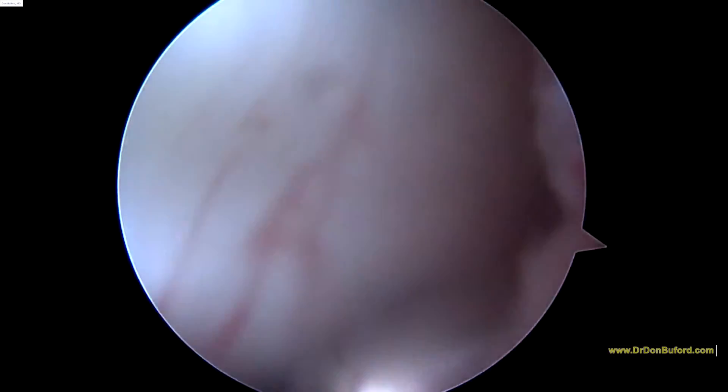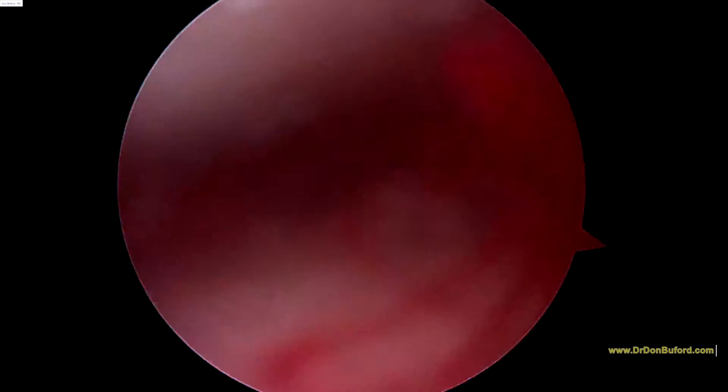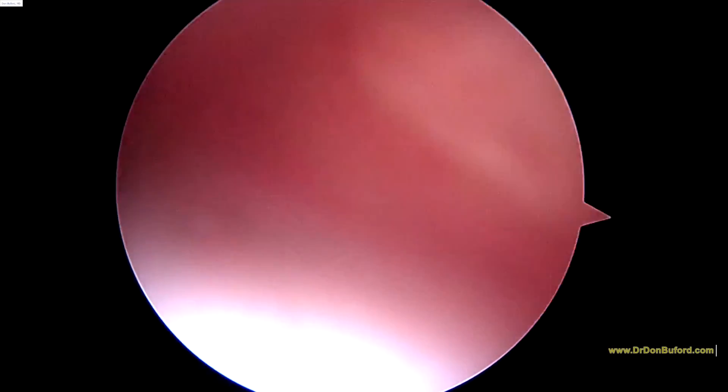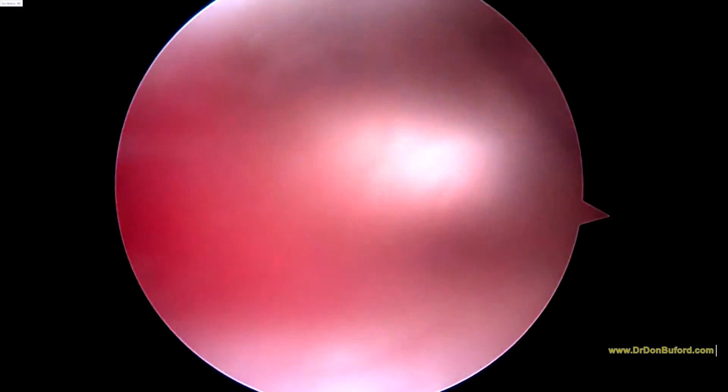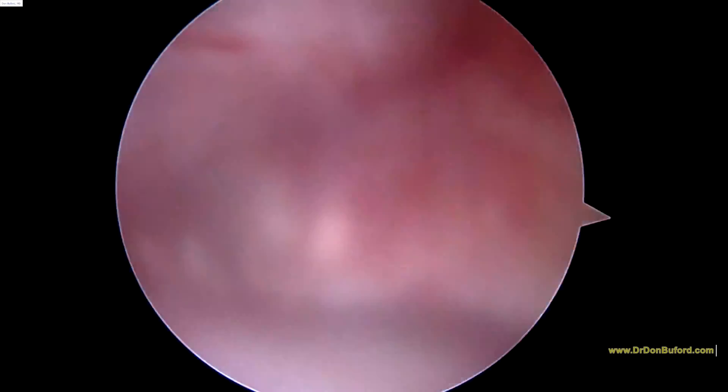This is it right here. You can follow this all the way down to the front of your knee, and that looks just fine. A little bit of bleeding — we'll stop that before the injection. But otherwise, I think we're going to finish up there. I really hope this does the trick for you. Good luck to you.